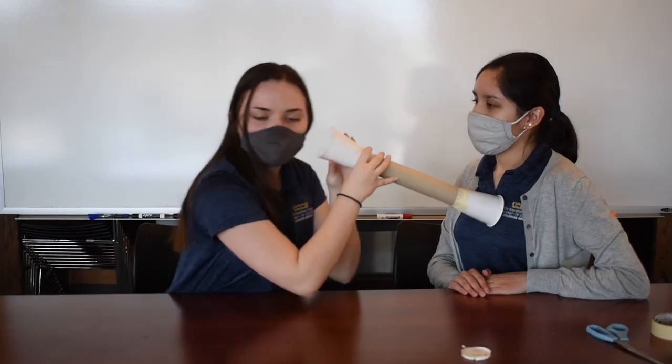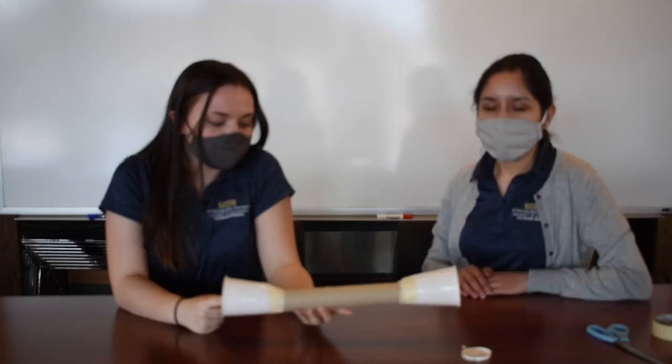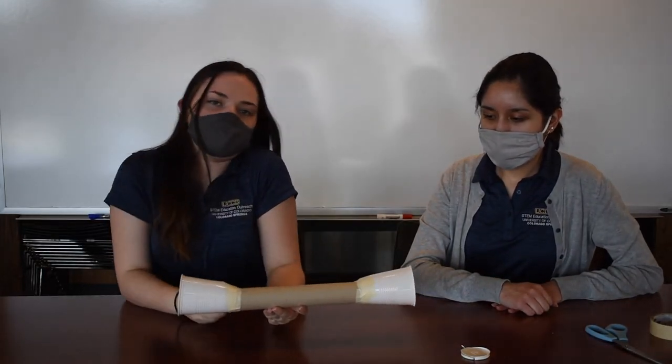You can put it up to your friend's heart, put it up to your ear, and you'll be able to listen to their heartbeat because the sound waves will travel through one end of the cup, through this tube, and amplify it into your ear.